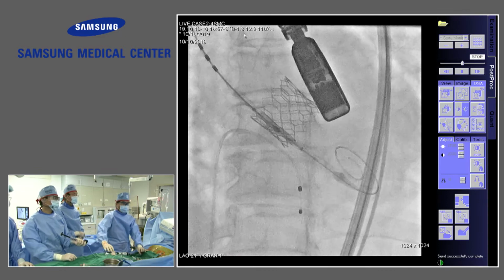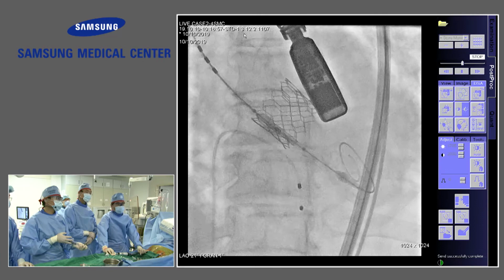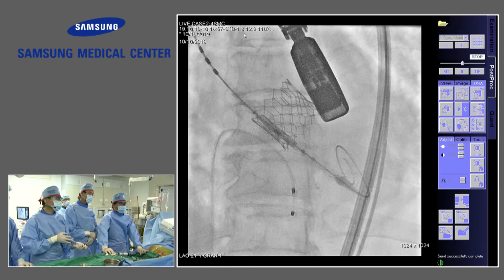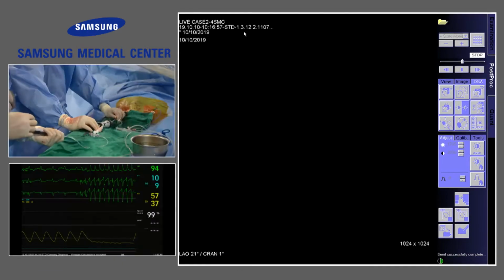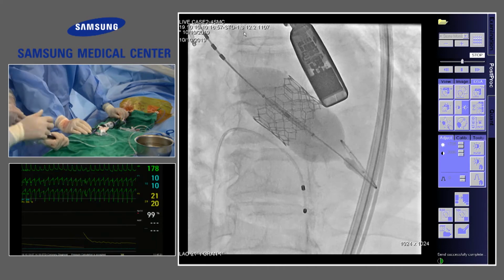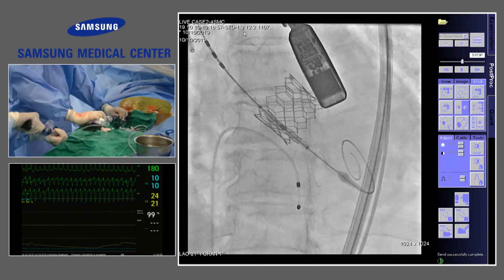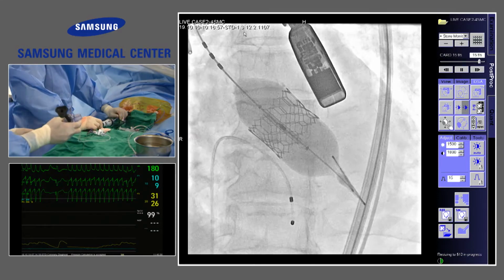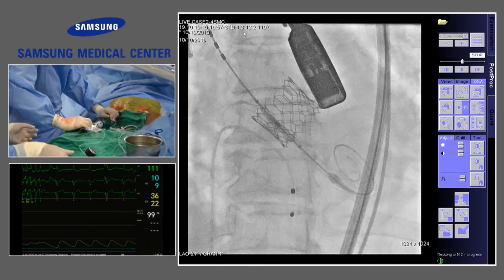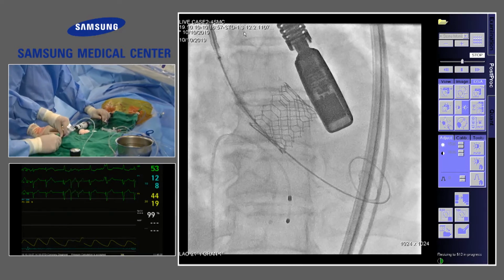Okay. So pacemaker ready. Okay, 1cc overfill. Now 1cc underfill. Did you remove it? Pacemaker on. Balloon. Balloon. 1, 2, 3, deflate. Deflation. 4. Pacing off. Okay. Same balloon. Same balloon, 1cc more. 1cc more. Okay.